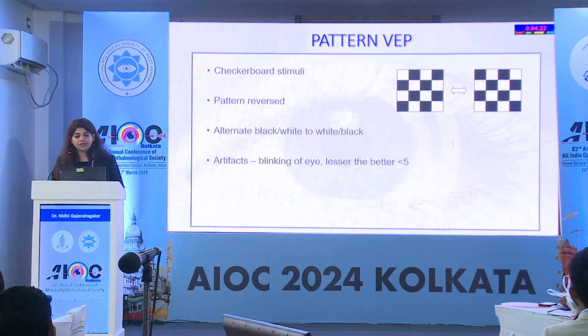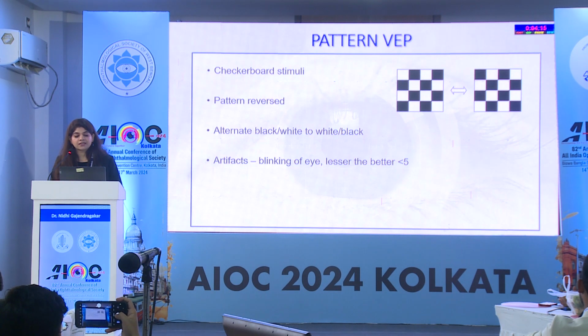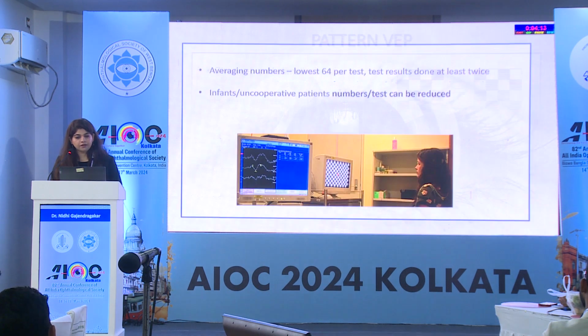So in pattern VEP, this is the checkerboard stimulus. The pattern is reversed, black to white and white to black. Here we need to avoid artifacts like blinking of the eye, the lesser the better.